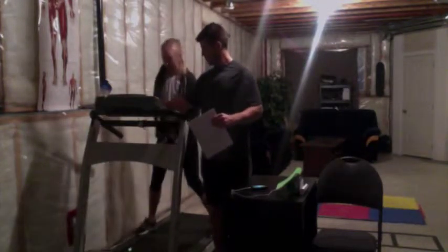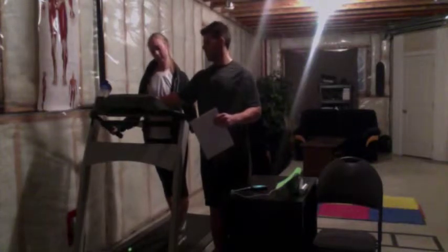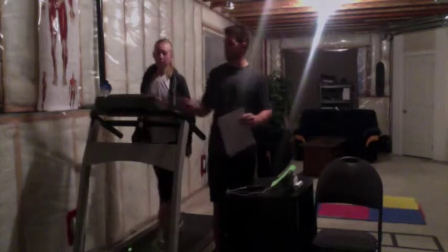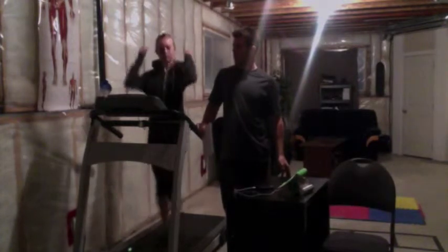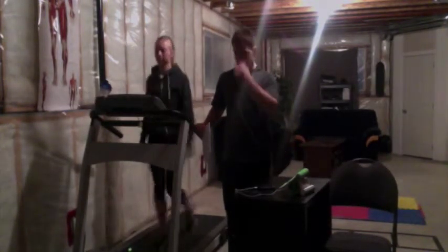Go ahead. Here it goes. We're gonna get a nice warm up. We're gonna walk at 3 miles per hour for about 5 minutes, and then over the next couple minutes we're gonna get our heart rate up.